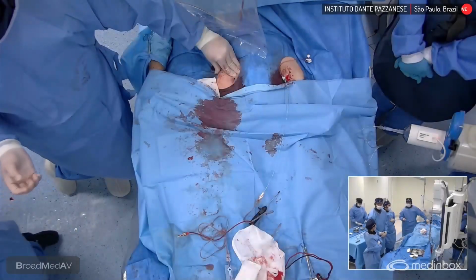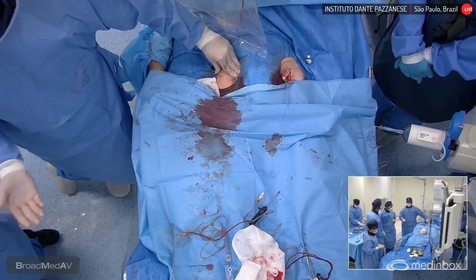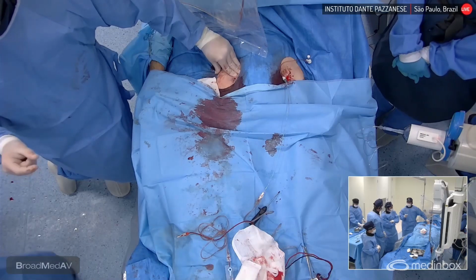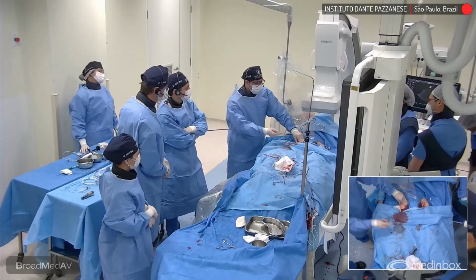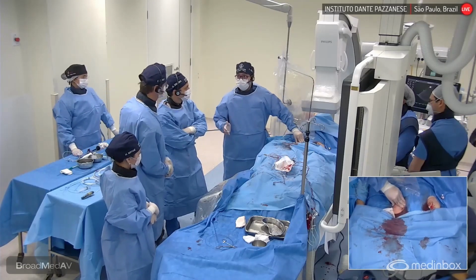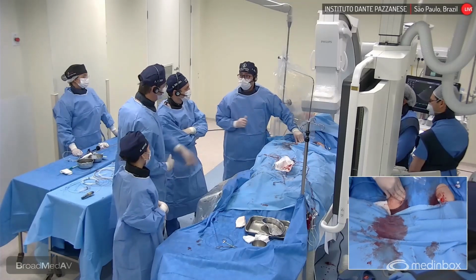Go ahead. When we have no calcifications, in my opinion, the access goes better than when we have calcifications. In this particular scenario, we have no calcifications at the stenosis point, the 5.2. So we performed a contralateral protection. If we have an accident, we are able to go with a balloon and inflate the balloon.